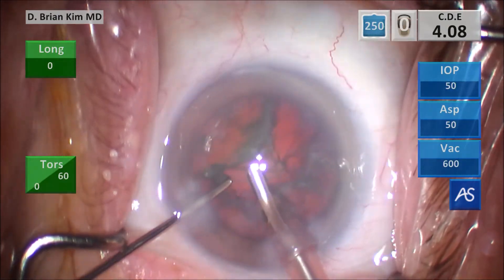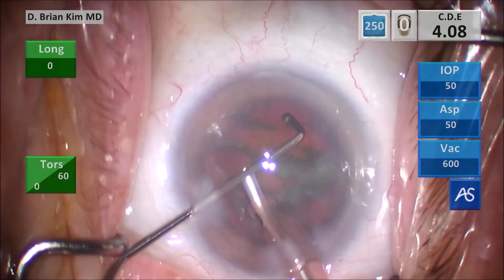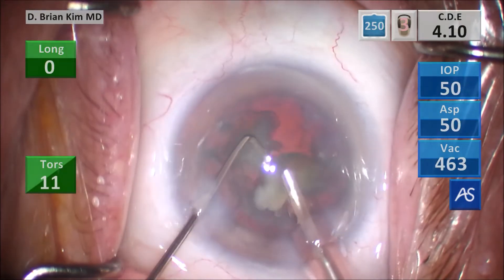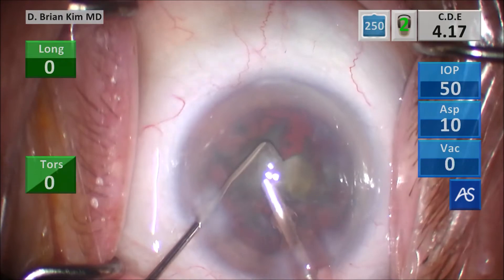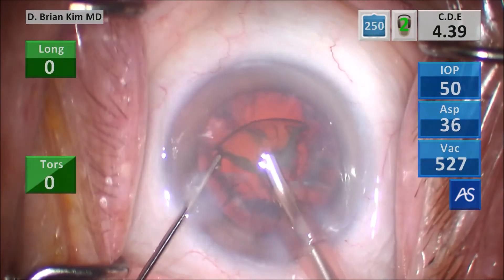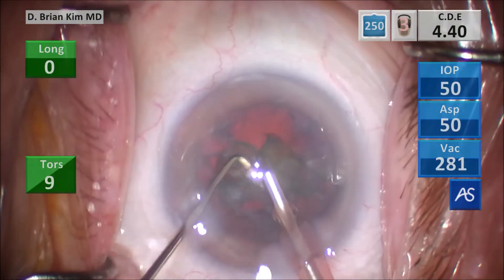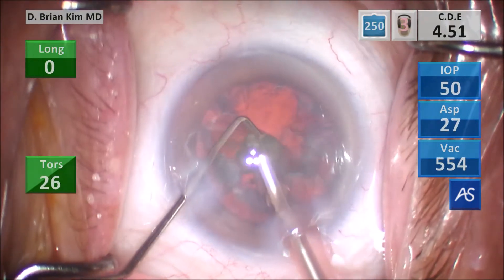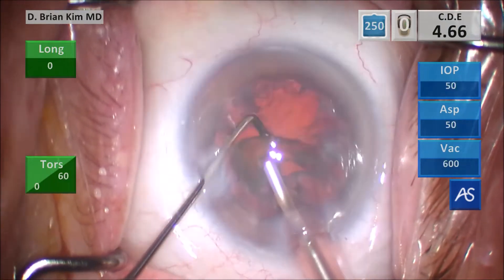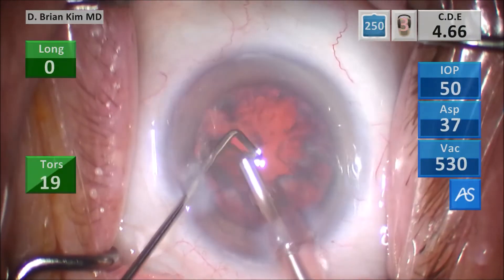This is the last quadrant — placing the chopper around the lens, hooking the peripheral lens at the equator, pulling it towards the phaco tip, fracturing it in half, and then using successive crushing forces to emulsify the lens pieces. Using successive mechanical fracturing forces to emulsify the lens piece.